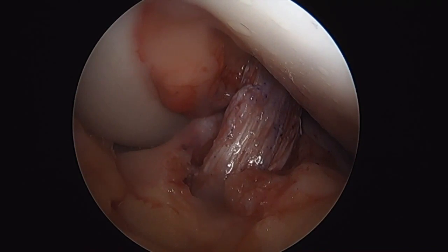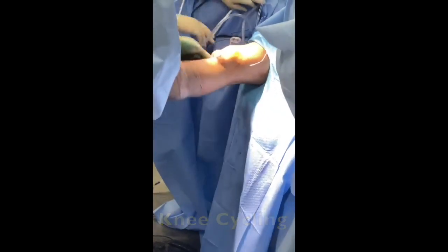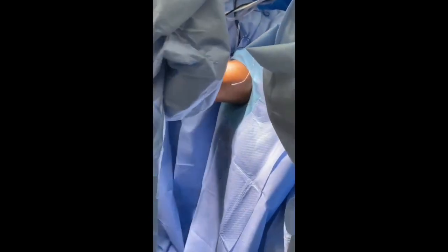Ensuring optimal tension on the graft prior to fixation is crucial to optimizing patient outcomes postoperatively. Inadequate graft tensioning can result in excessive knee laxity, thereby increasing the propensity for the development of osteoarthritis.